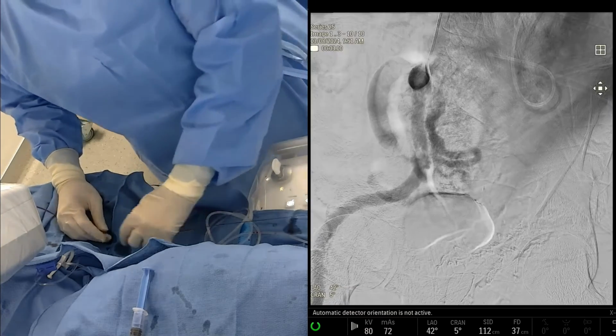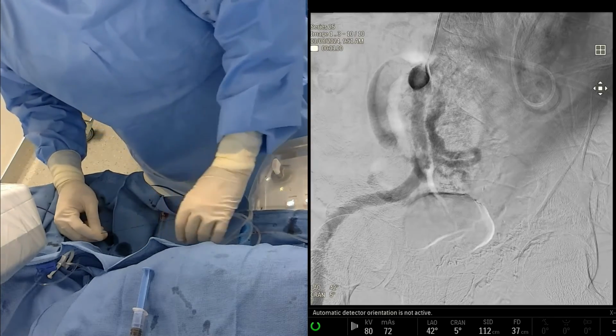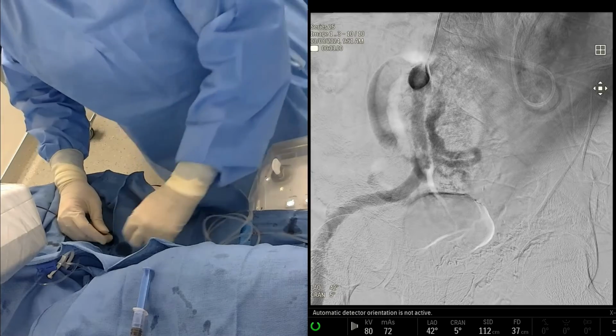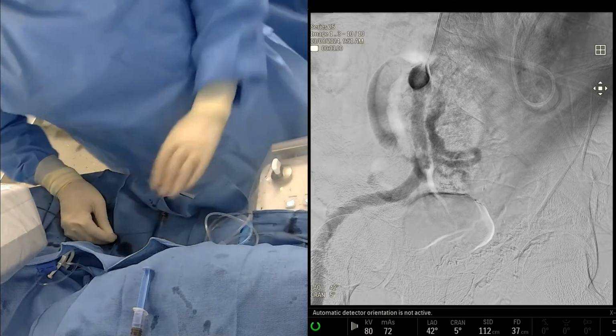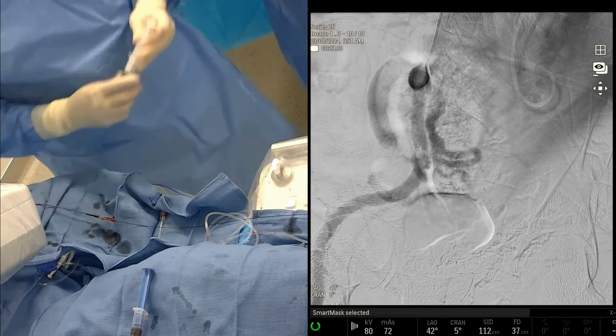And that patient, I believe, if I remember correctly, had a vessel that we missed initially. So it wasn't that the glue failed; it was just that we didn't locate the collateral, which I believe was off the umbilical artery, if I remember correctly.